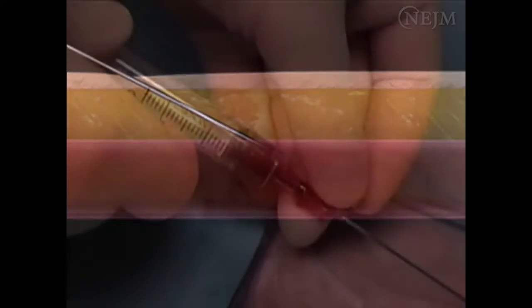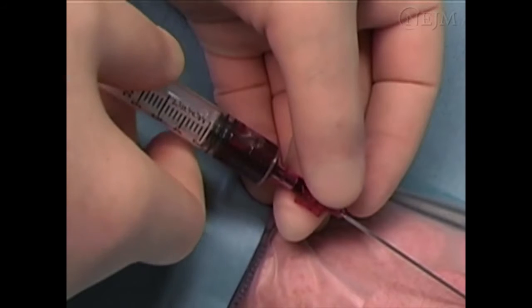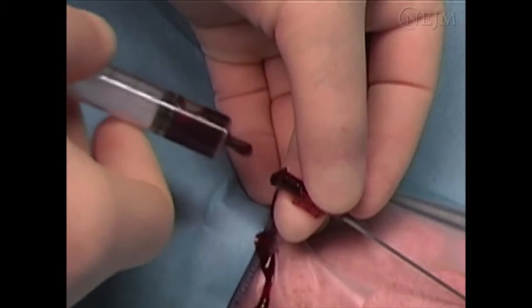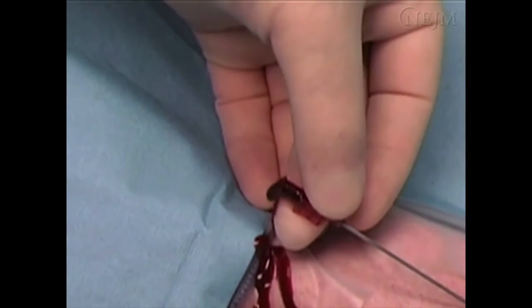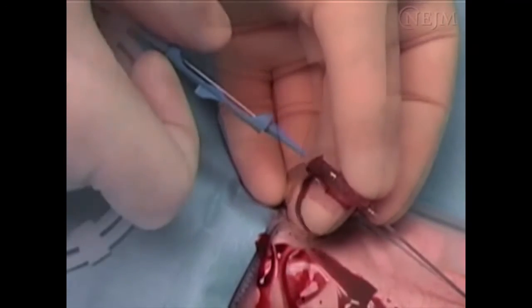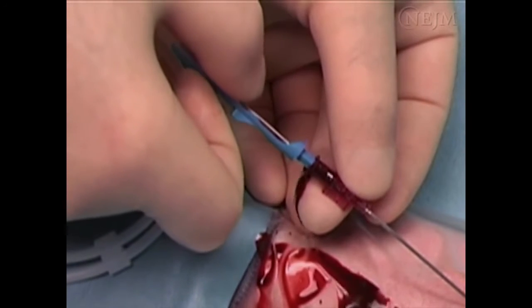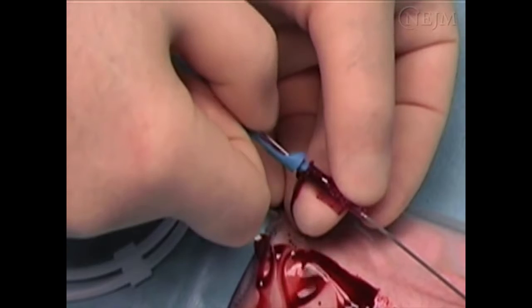Once the needle has entered the vessel and steady blood return has been obtained, maintain a steady position of the needle with the non-dominant hand while gently removing the syringe. Dark, non-pulsatile flow confirms access to the vein. Once the needle is in the vein and free flow of blood has been obtained, employ the introducer. Using the introducer, advance the curved end of the guide wire through the needle.